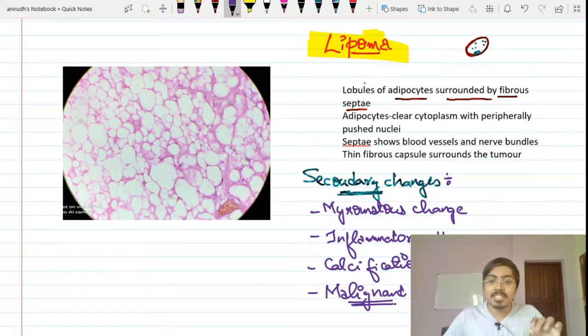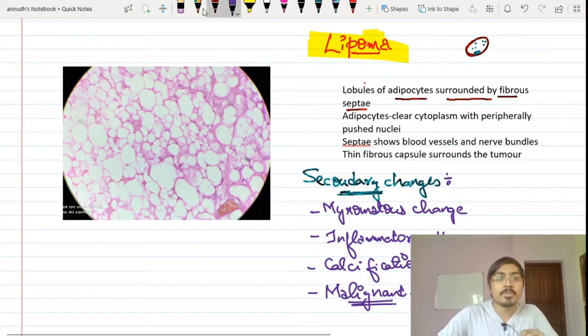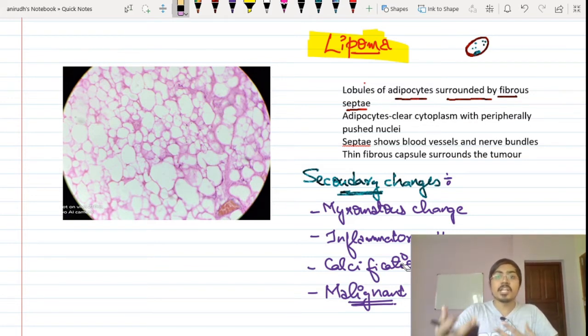And this malignant tumor called liposarcoma, I think you will not be able to visualize everything over here. So this malignant tumor called liposarcoma is actually not from lipoma. It is a different kind of origin for that tumor. Primitive mesenchymal cells are going to form the malignant cells, and not a secondary change in lipoma.